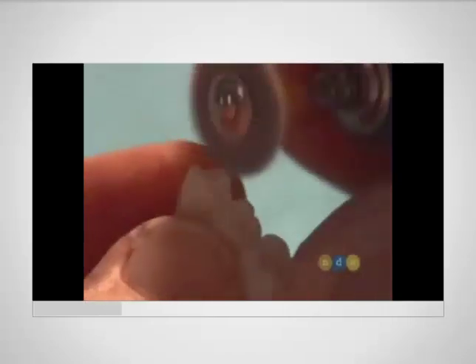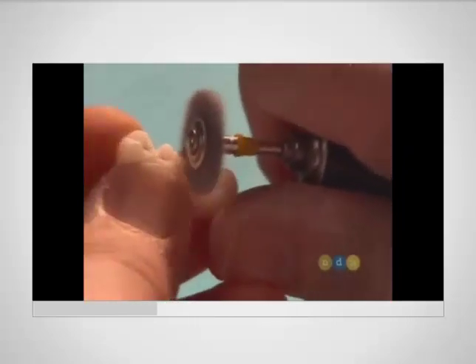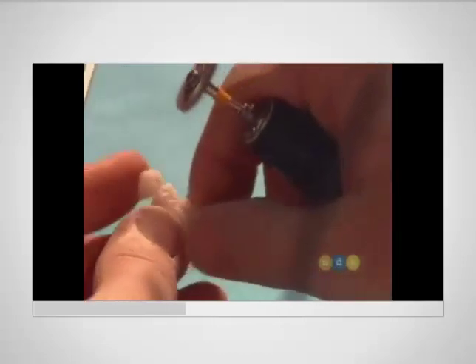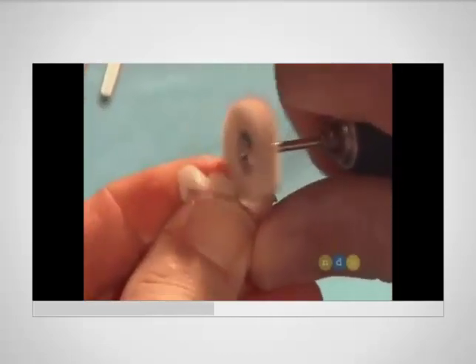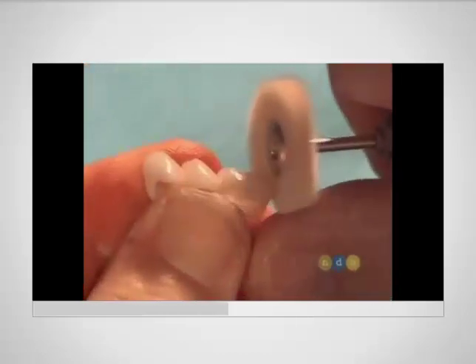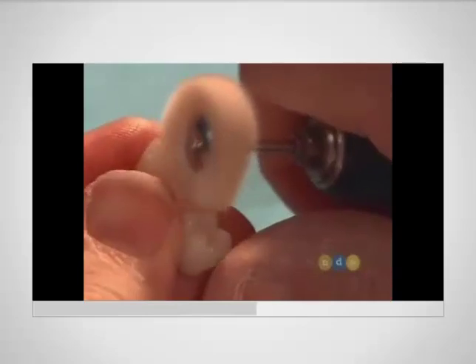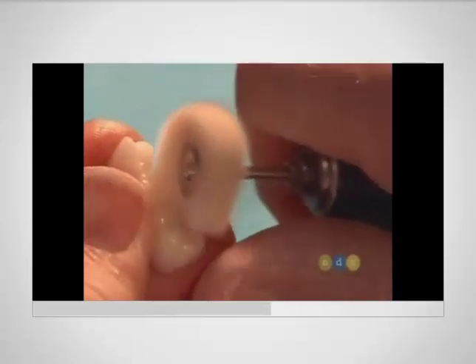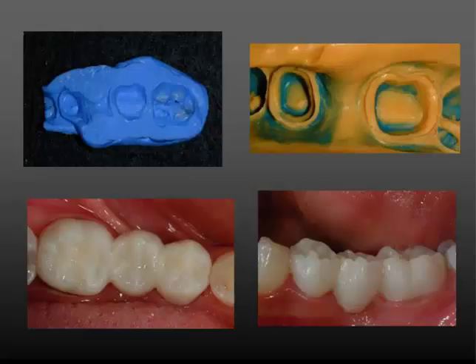If you move the brush in different directions, you can just wipe and go. If there's a definitive wax-up, I would be finished already, but since I did a little bit of carving on the occlusal, I'm using a medium bristle brush — you see how quickly that brings a polish. Followed by a shell wheel, or a small muslin wheel, and you'll see the luster that comes onto that. It's gorgeous.